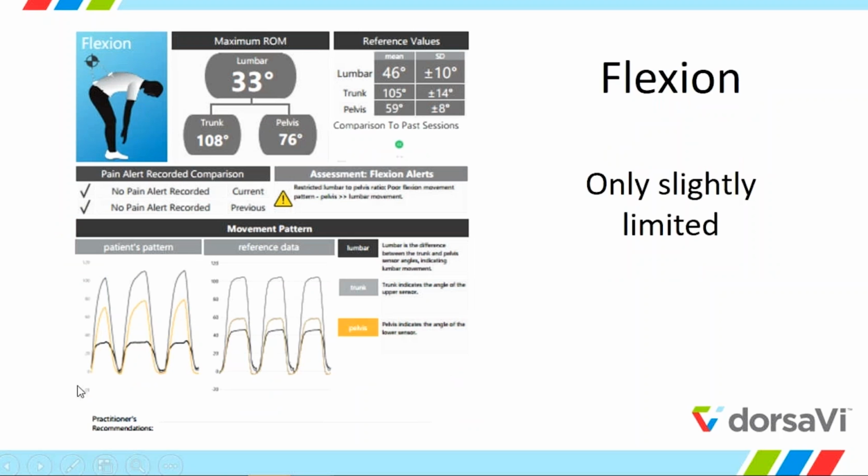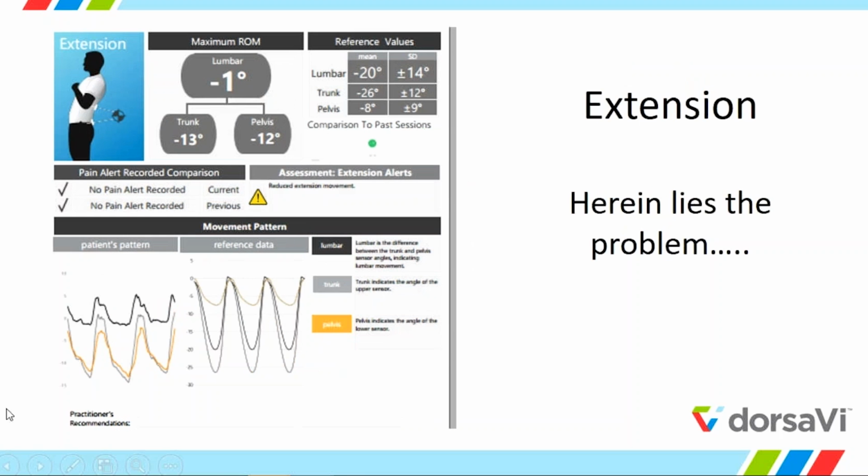And you can see how he moves. You wanted those lines to be gray, yellow, and he doesn't really resemble the curve correctly, but each curve is different. Sometimes he holds the motion, but if you put standard deviation, he doesn't look so bad in flexion, he can move. It's not so bad. But when you come to extension, it's even more scary.